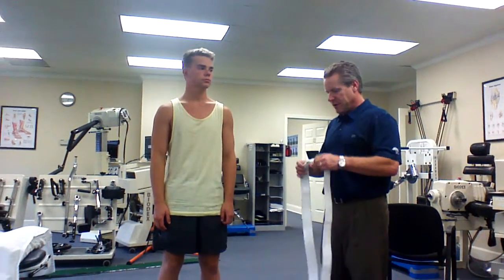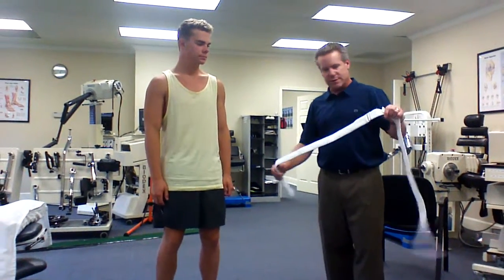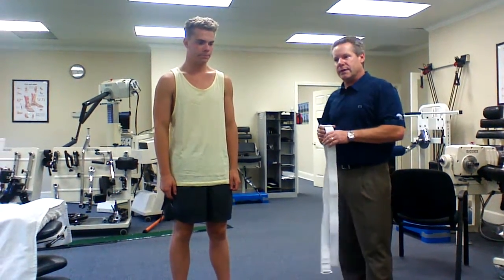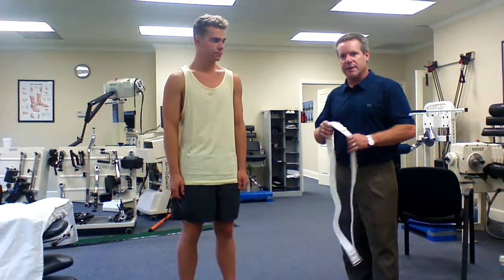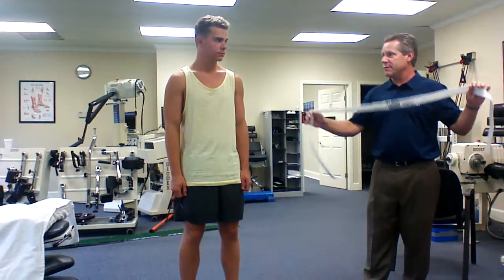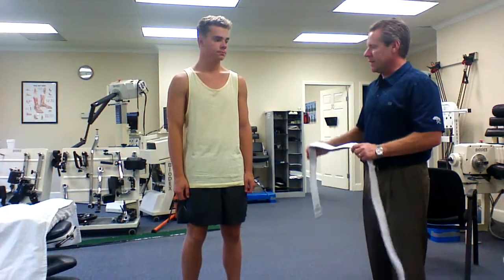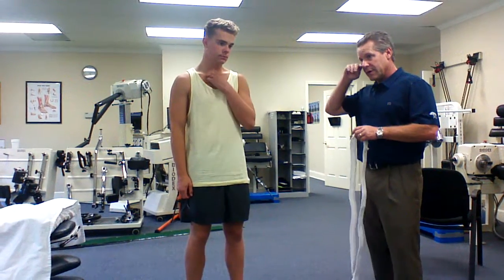So this is a sacroiliac belt. This is actually two small ones that I've combined together. I have learned to never walk into a room with a garment that is too small, especially for a lady. So this one will go around people twice — it's just for trial purposes and just to make sure that it's something they're going to benefit from.